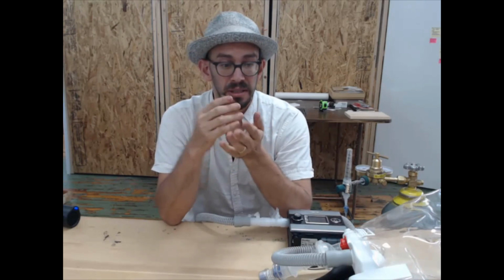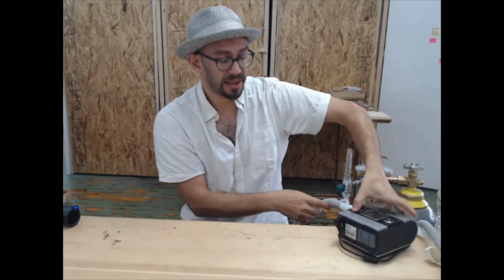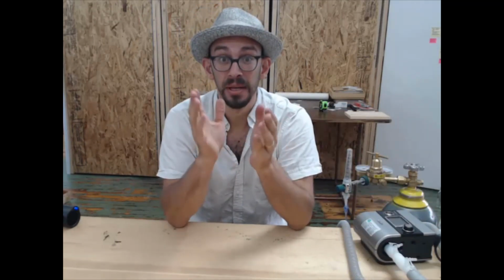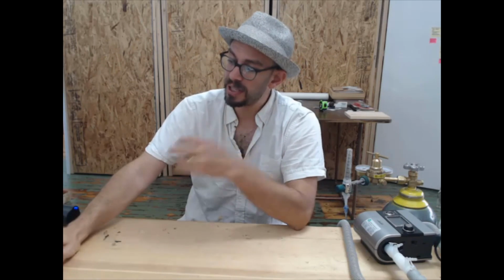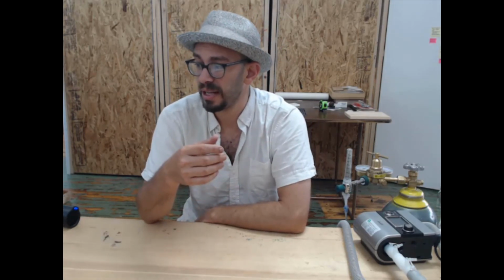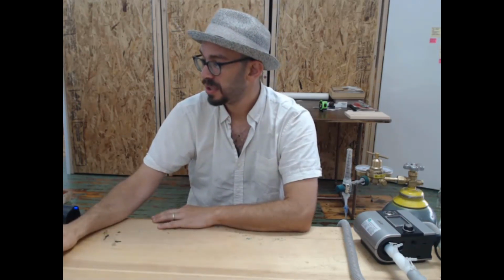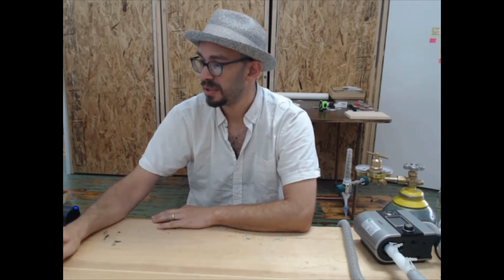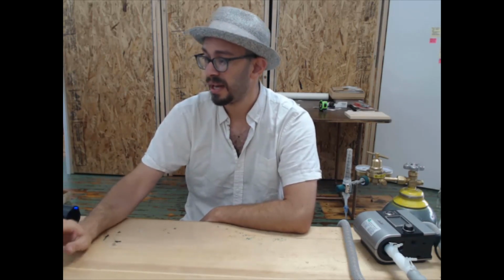That's about it on the details of how to adjust the patient's circuit and the ins and outs of how to work with it. What you'll see, I think, is always this repeated idea that the patient circuit, the way to make it safe, ensure you have adequate flow, at least 50 liters a minute through. There's an operating table for every model of CPAP that will show you how to adjust settings for the patient. And there's also a getting started guide which goes through your model of CPAP and how to adjust the different pressures and values, as well as get digital copies of this guide. So by all means, use that to your advantage as you need it.